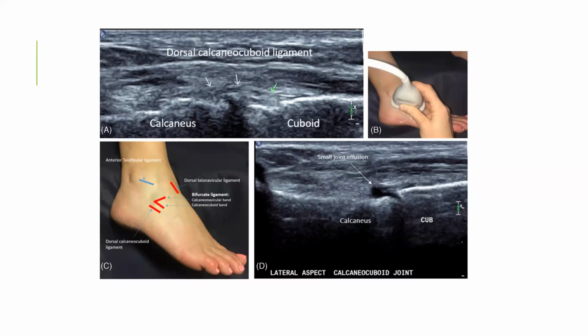Sir, in plantar fasciitis, what is the exact point of injecting the steroid? Wherever you scan and wherever there is decrease in reflectivity of the plantar fascia, that is the area to inject. Normally the problem is at the central bundle of the plantar fascia.